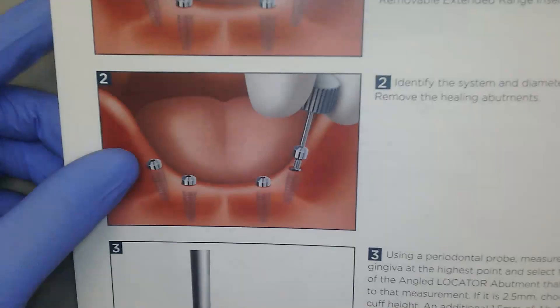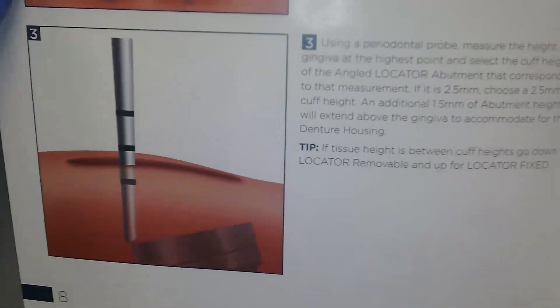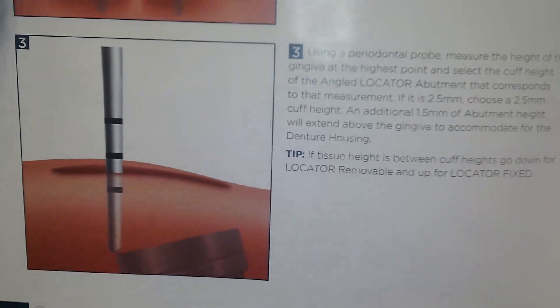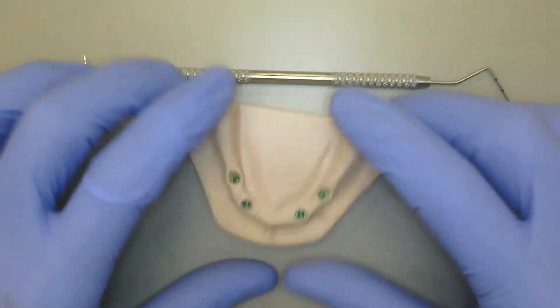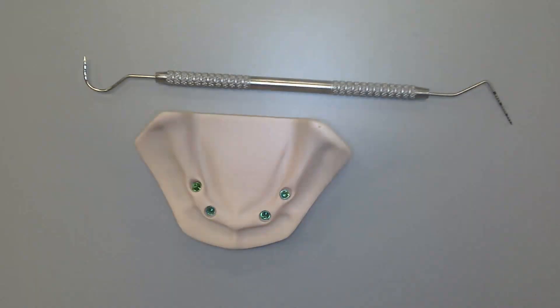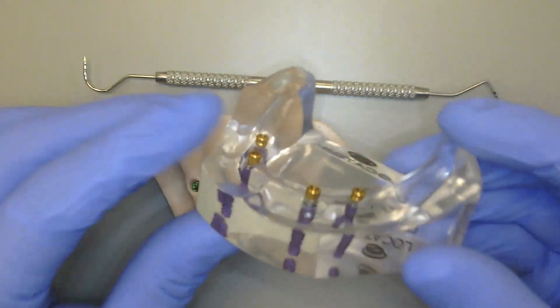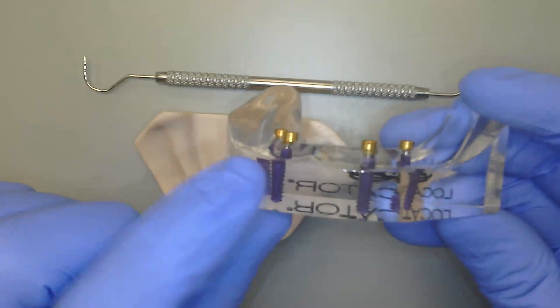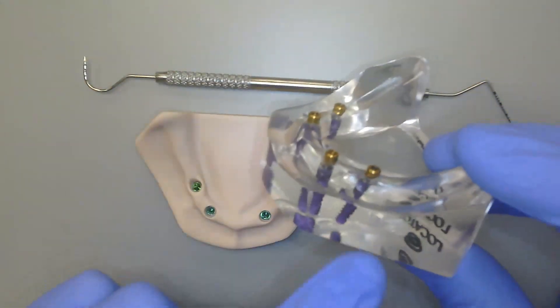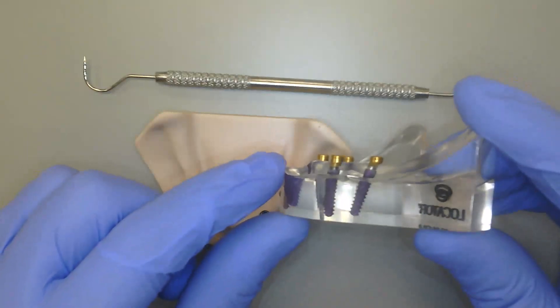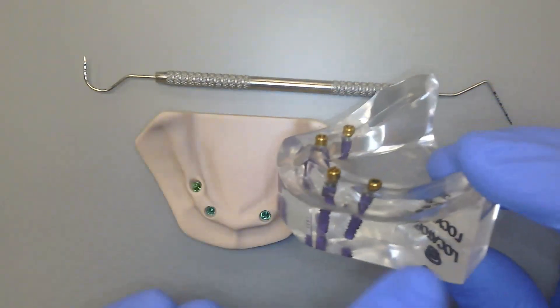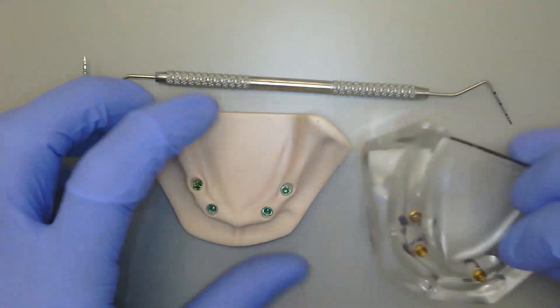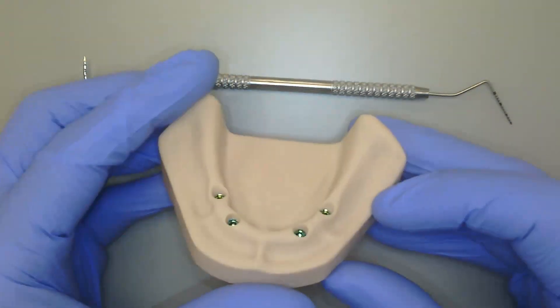Then I'm going to unscrew and remove the healing abutment, and I'll have a periodontal probe or instrument to measure the soft tissue depth all the way around my angled implant. What we have in front of us is a simulated patient and a periodontal probe. This simulated patient is essentially a patient that comes in where we want to put straight locator abutments in the front and locator angled in the back. The implants in the number 22 and 27 positions were parallelly placed, while we placed tilted implants in the posterior to avoid critical anatomy — such as the mental foramina or the mandibular nerve — where we now need to angle-correct for that 15-degree implant placement. I've created this model to make it easy to follow along.